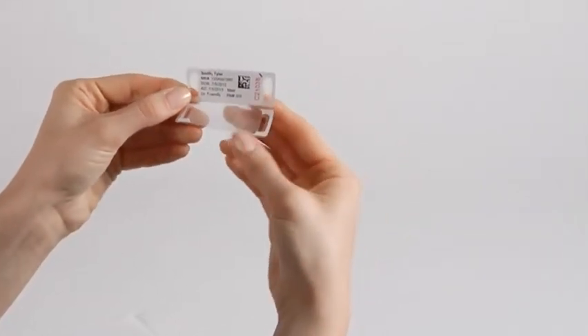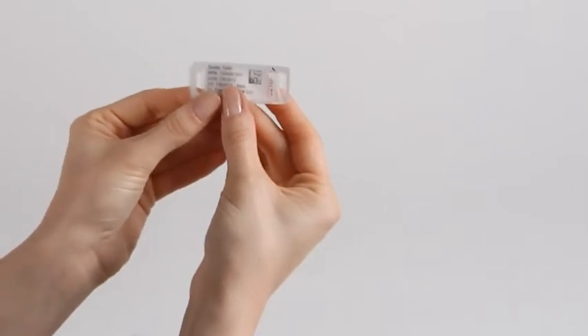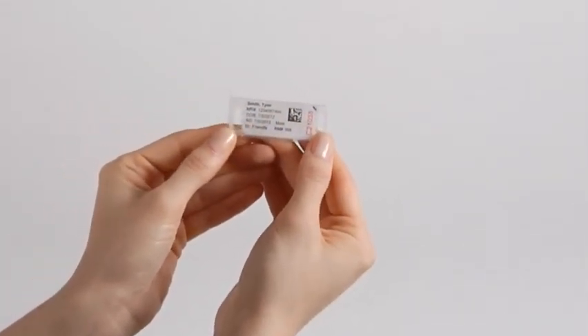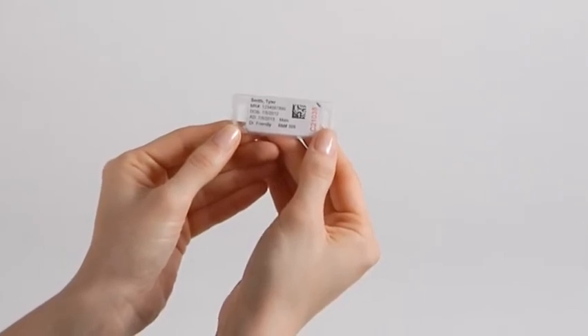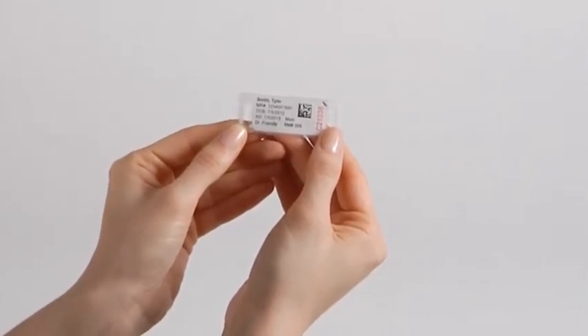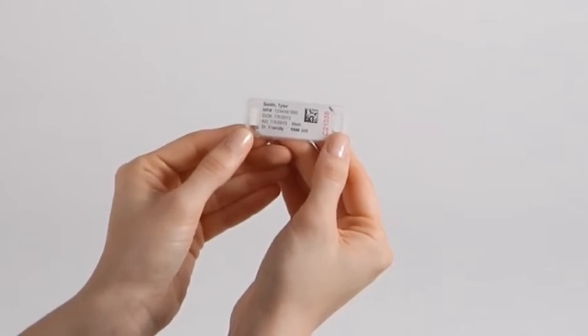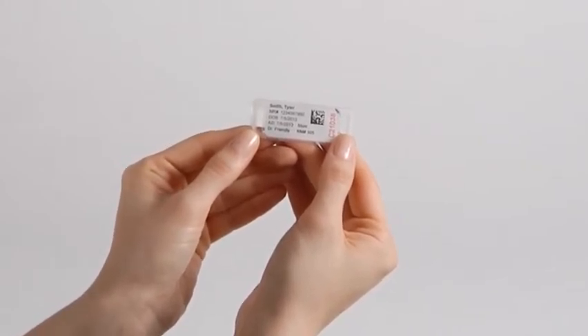Now, pinch the ID tag between your thumb and forefinger along the perforated area between the image area and the laminate window area. From this pinch point, press and smooth the lamination over the image area, creating the patented self-laminating water, alcohol, and solvent-resistant seal on the ID tag.